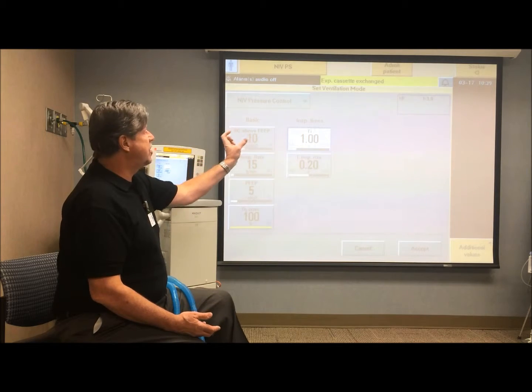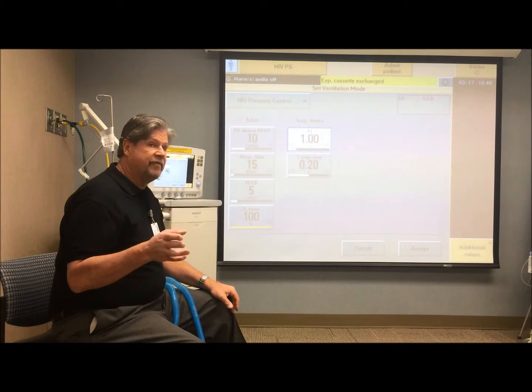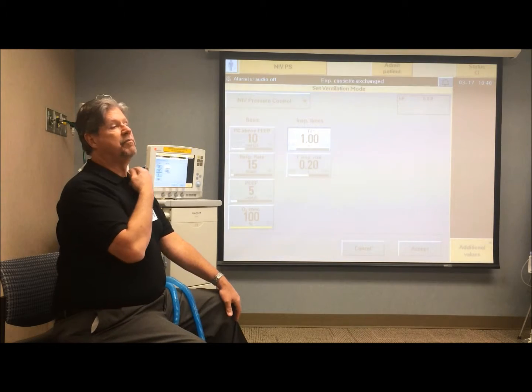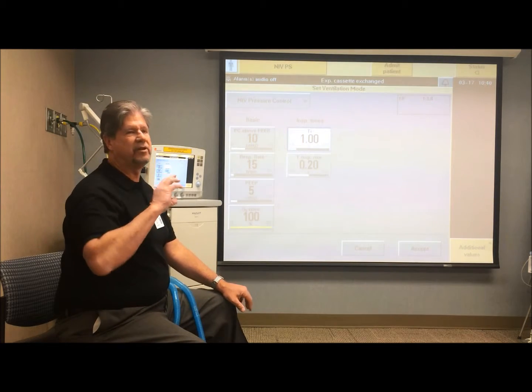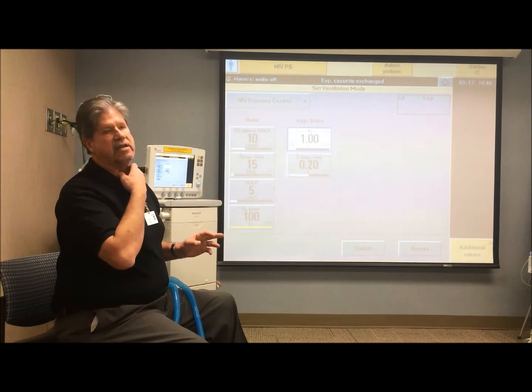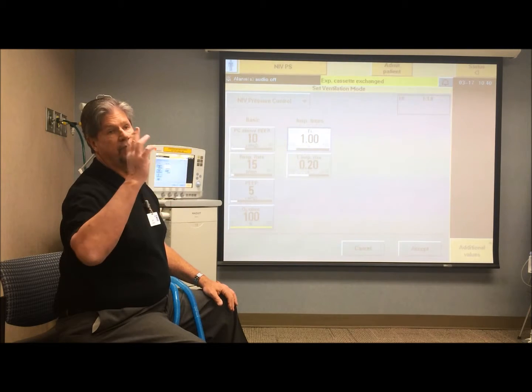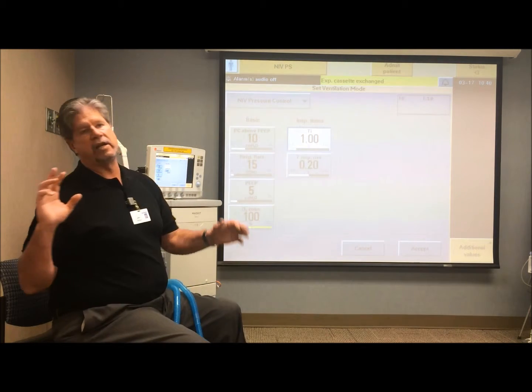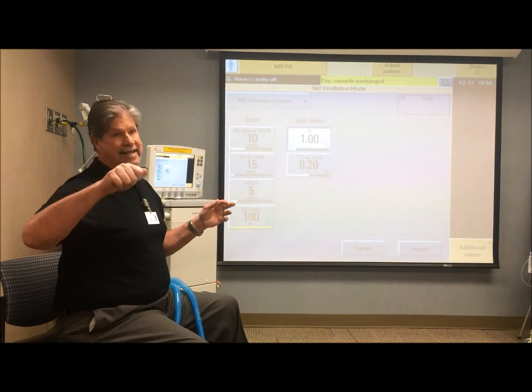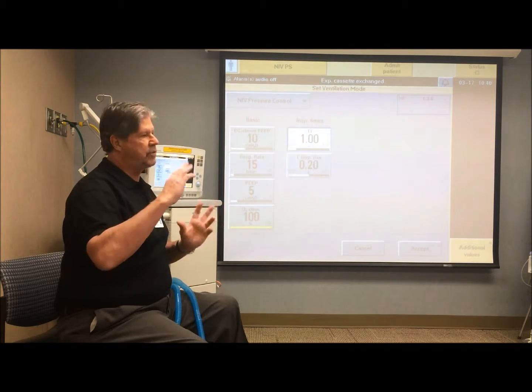The reason there's no button there is, let's go back to invasive ventilation. Let's say you had a patient that had a tube in, but the cuff was giving you problems, and you couldn't put any more air in it. And when it was in one position, the cuff leaked. So consequently, what would happen to the ventilator? It would auto-cycle, right? So if it was auto-cycling because it was in this position, you'd have to go to the ventilator and make it a little bit less sensitive by turning the flow trigger from 5 down to 4 or 3 or 2, then it would stop cycling.